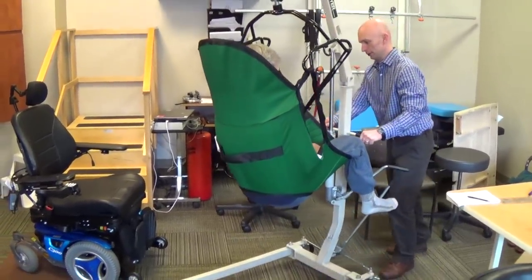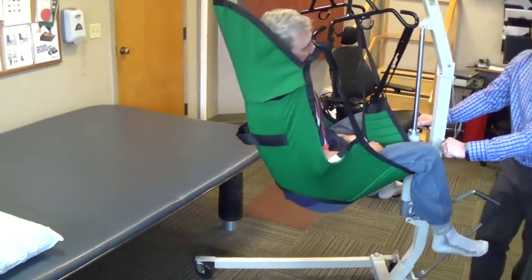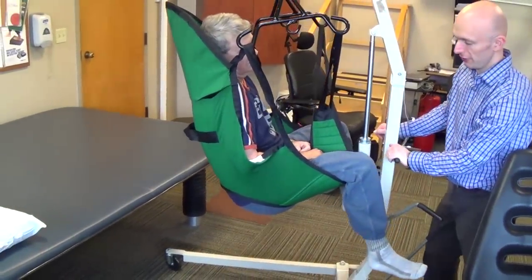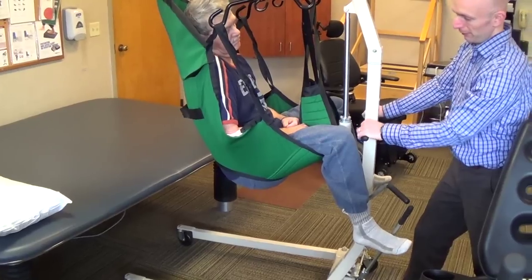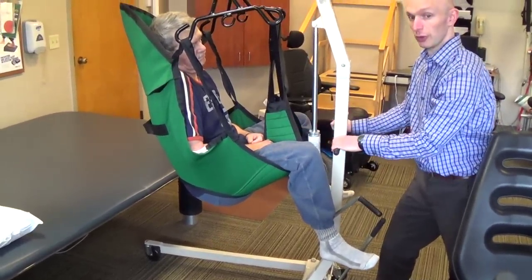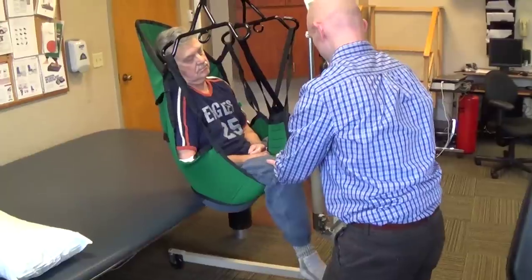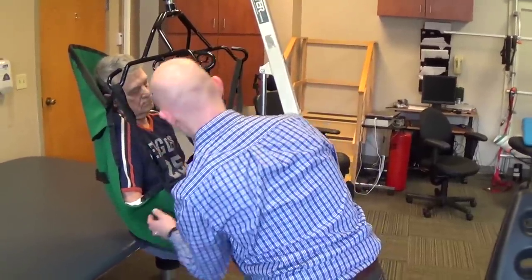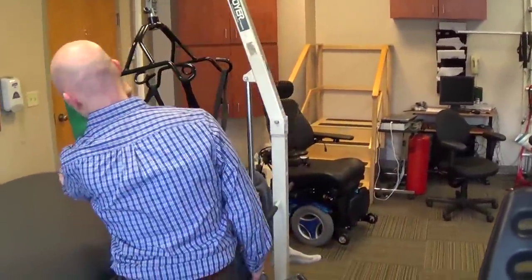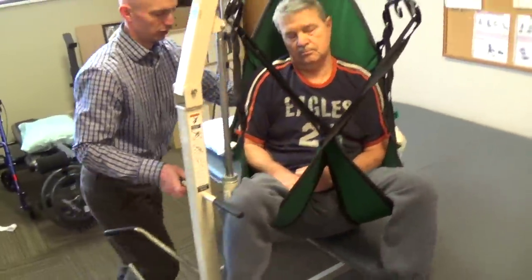We're going to go to our bed. Making sure the area under the bed is free of any materials, or any cords or lines or tubes are tucked away and placed to the opposite side. You might be required to lift the client up a little bit more so their bottom clears the edge. I'm going to use the handle. I'm going to move the leg around. And then I'm going to push in.